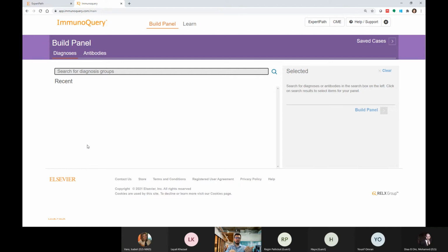Or in the other way around, if we think about the immunohistochemistry panels that are very common as an initial study to rule out some type of diagnosis or some type of disease, especially when we're talking about, for instance, carcinomas or cancers. We could also have the situation where we have a profile that doesn't fit our expectations or what we would expect in case of the clinical background of the patient.